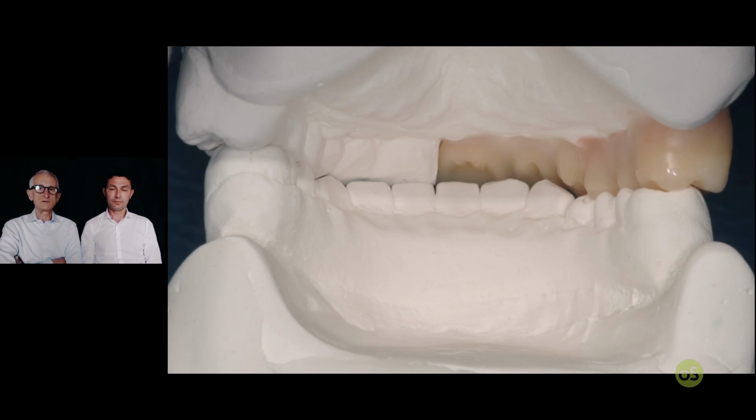So this is one of the reasons why sometimes the dentists complain, because they get the shell, they extract the teeth, and they try the shell, and the shell starts to rock, starts to be unbalanced, and so they don't understand that. They ask the patient to bite down, and then they end up cracking or crushing the shell, right? So this is because the lab technician is being too generous to remove the plaster. Okay. And sometimes you have some mistake in the vertical dimension, because if the shell doesn't fit, for sure you increase the vertical dimension. Oh.